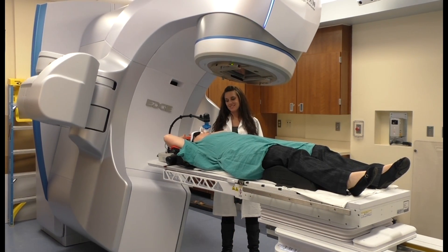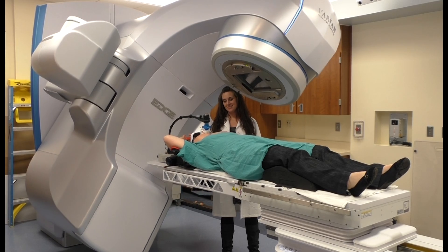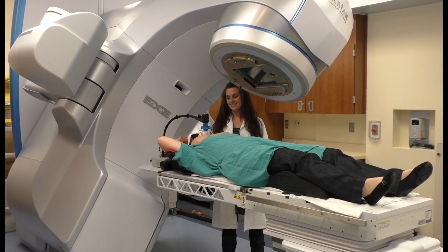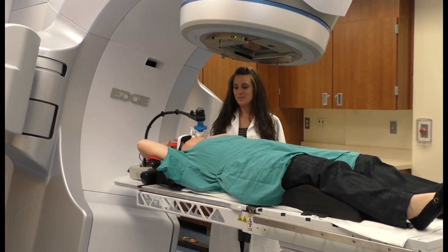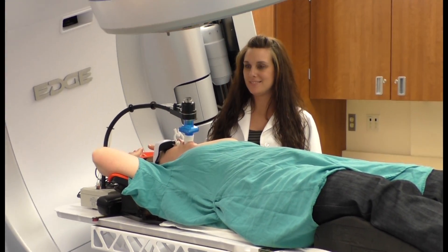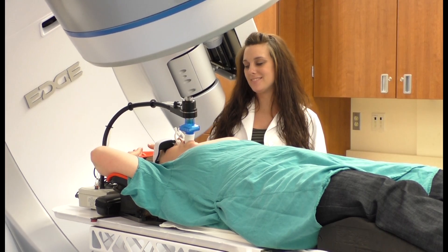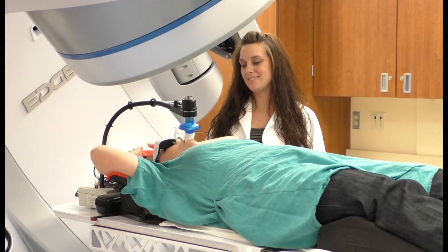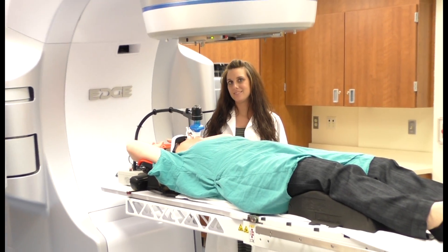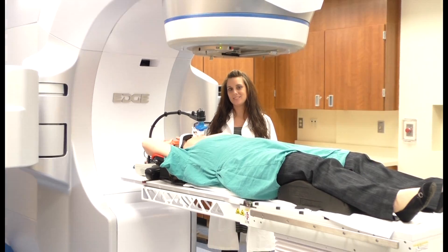As you can see, whether upon inhalation or exhalation, the breath hold remains voluntary and always under your control. In the treatment room seen here, the process is essentially the same as it was for the simulation room. We hope this preview alleviates any concerns about breath holds during imaging and treatment, and your therapist will be in constant communication to guide you through this voluntary breath hold method. Don't hesitate to ask any questions or share concerns — your therapist and entire medical team are here to help.